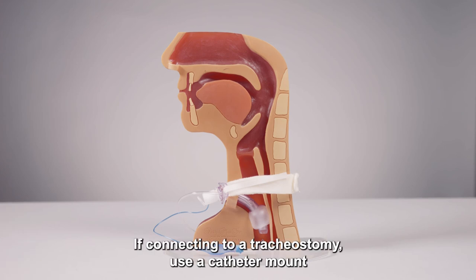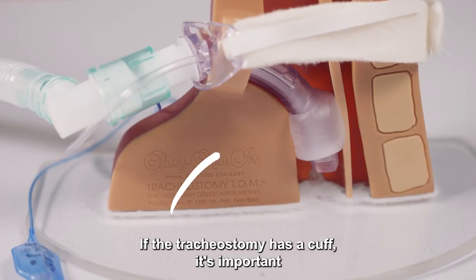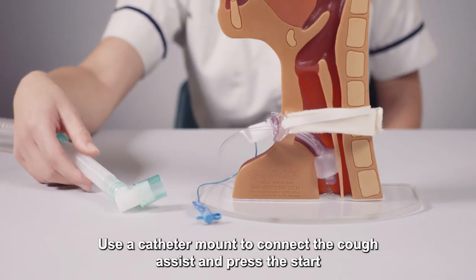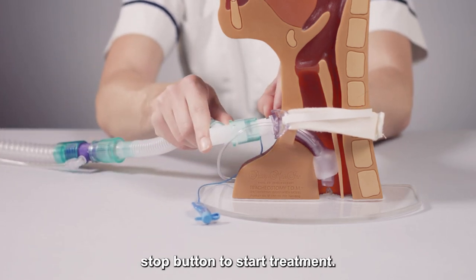If connecting to a tracheostomy, use a catheter mount or tracheostomy connector. If the tracheostomy has a cuff, it's important to inflate it to reduce the amount of air leaking from the site. Use a catheter mount to connect the Cough Assist and press the start/stop button to start treatment.